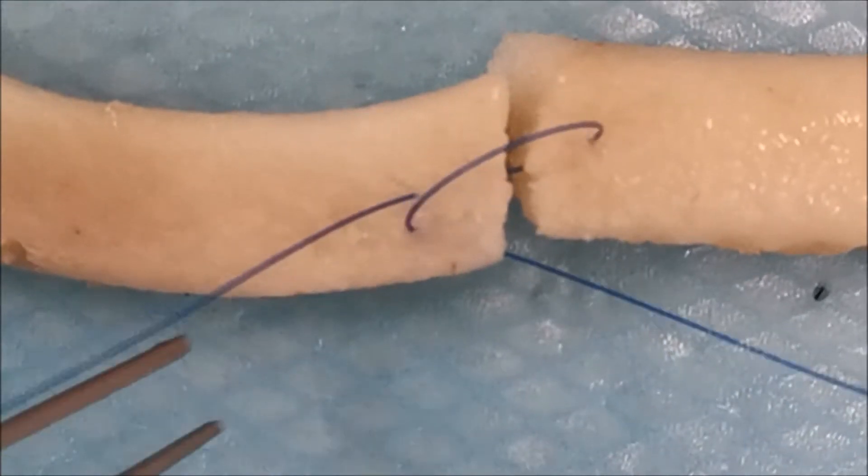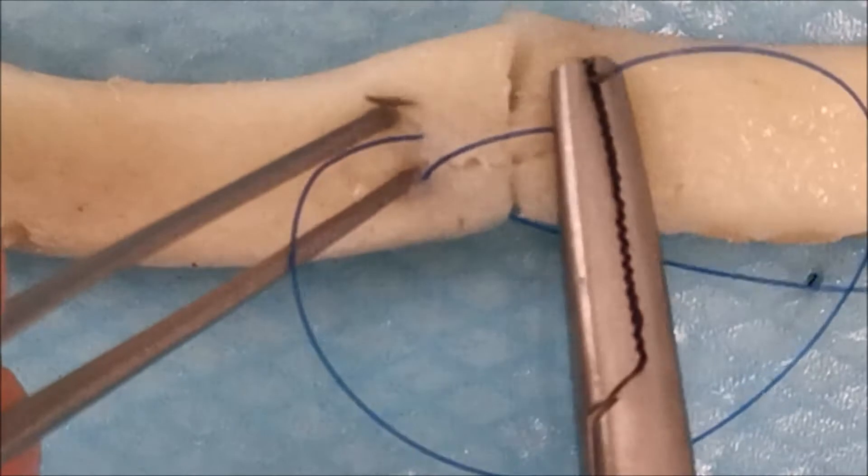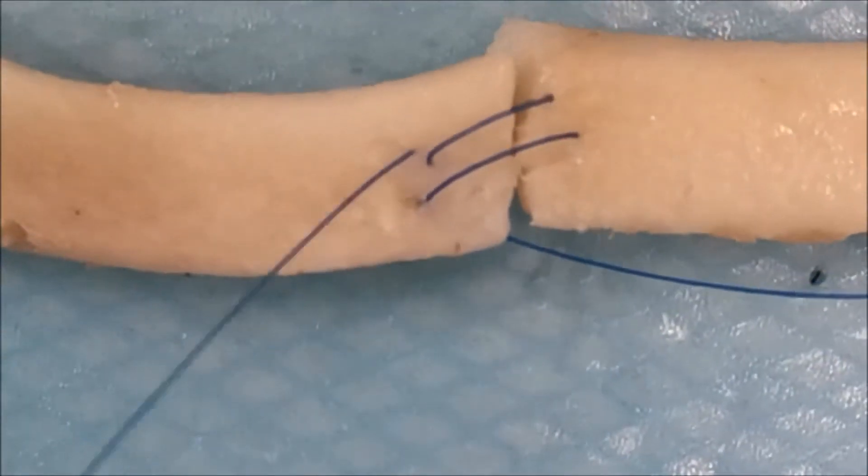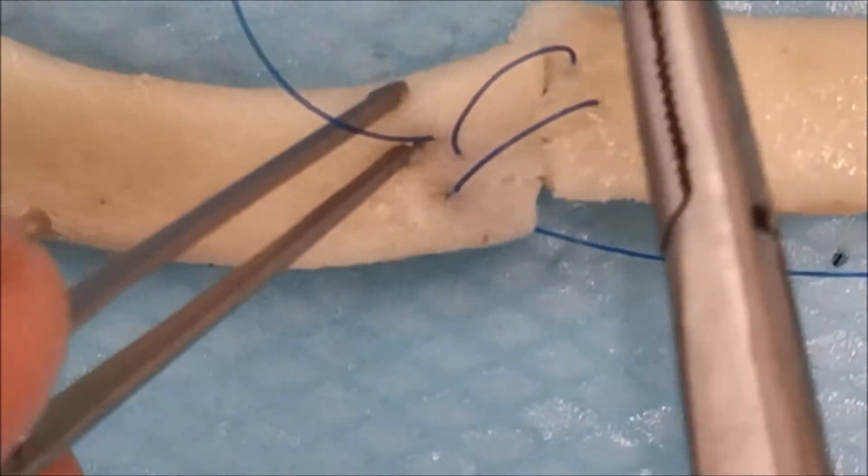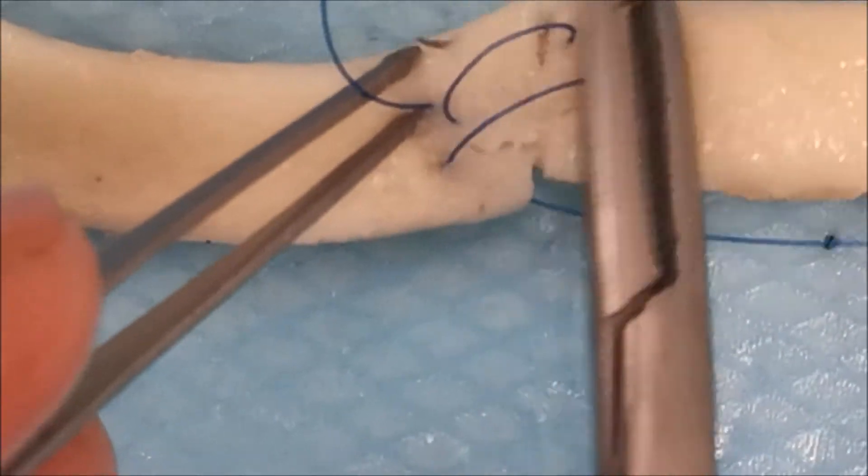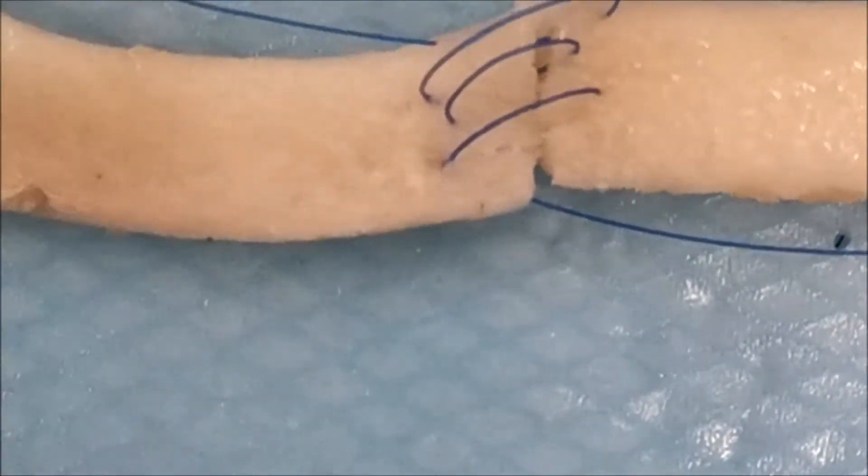This will weaken the tendon repair and result in a rupture during rehabilitation. Normally you would do smaller bites. For the purpose of demonstration, I've taken bigger bites here.